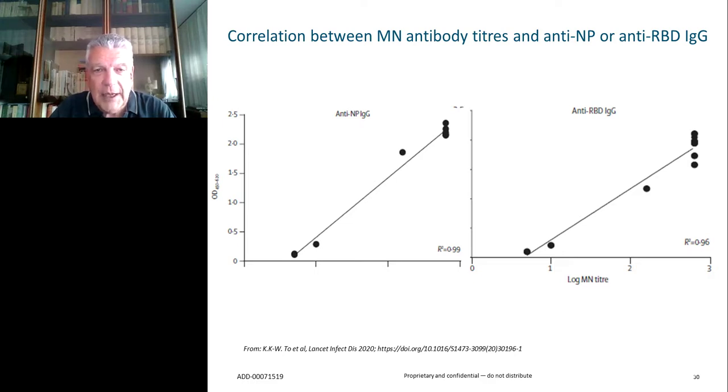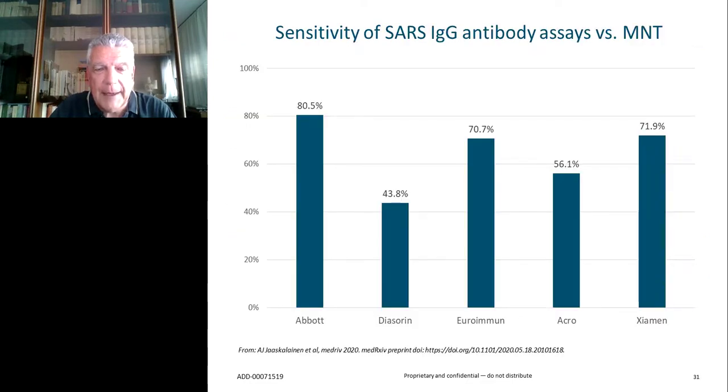And if you wish, you may go to a direct evidence concerning the RBD assay by two different levels of testing. This has been done in a very recent paper by Finnish authors, in which they ascertained the concordance between neutralizing activity and the positivity for IgG antibody checked by different assays. You see, we are dealing with this one in this specific case, and out of all samples that did show neutralizing activity, the assay was positive in 80%, which is higher compared to the other assays.